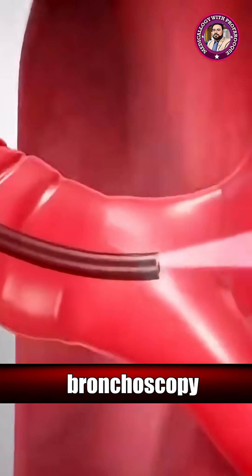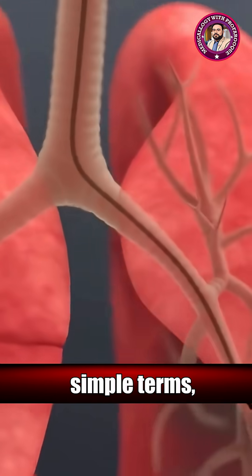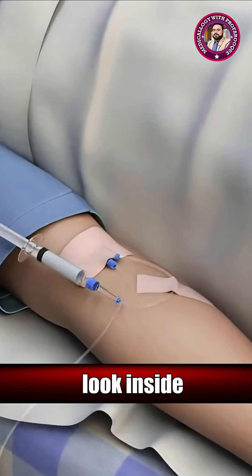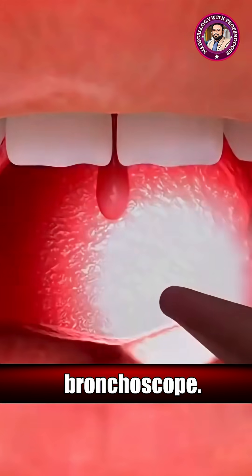This 3D animation on bronchoscopy gives you a clear understanding of the procedure. In simple terms, bronchoscopy is a medical technique that lets doctors look inside your airways and lungs using a thin, flexible tube called a bronchoscope.